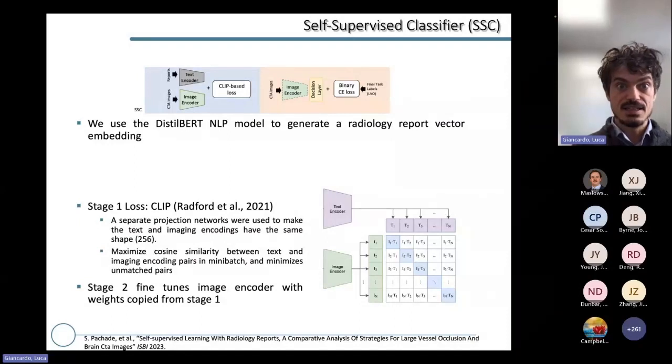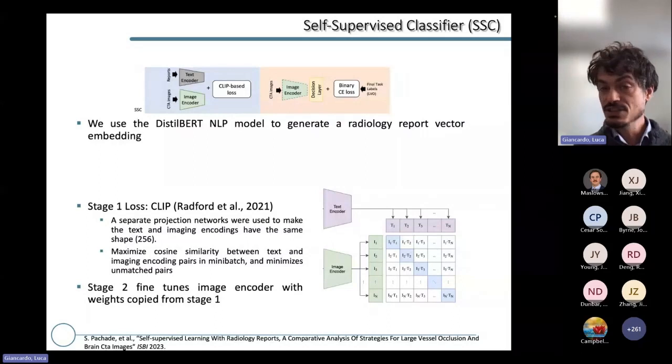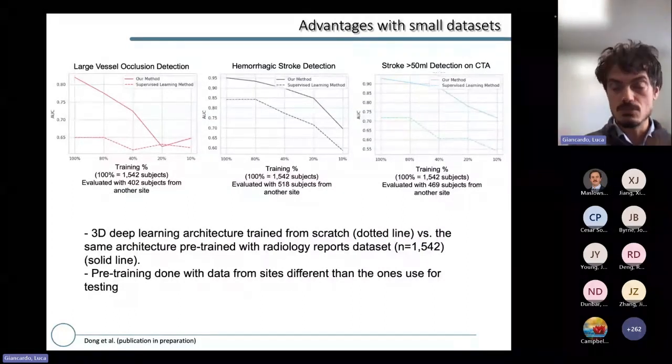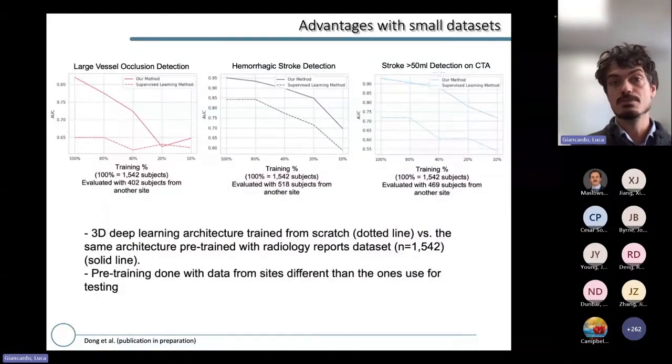Also note that this is the first time this is done in these projects with 3D medical imaging, and the reason is that current artificial intelligence models are typically used to images based on natural images. So whenever we try to translate these to our environment, there are always challenges. This model starts from zero, which is great because it doesn't have any information about things that might be common in natural images but are not common here. We had this paper published with a smaller data set, but now we are moving forward and doing this with multiple tasks.